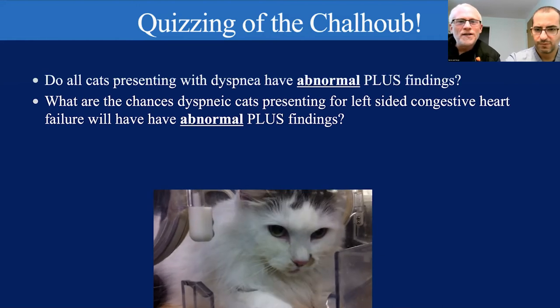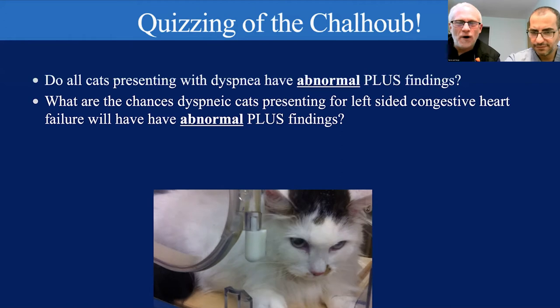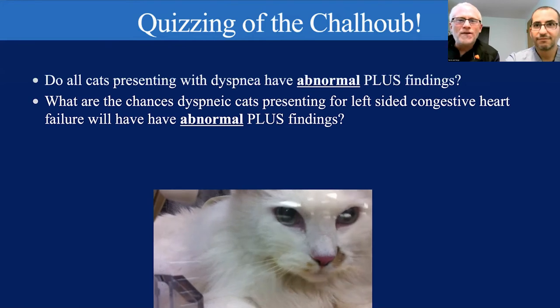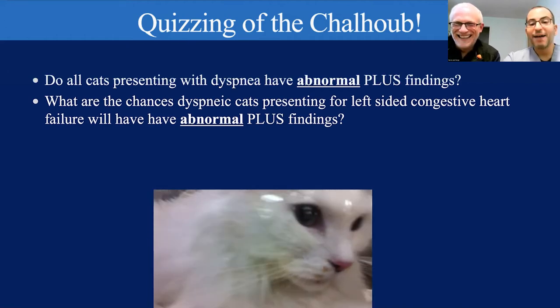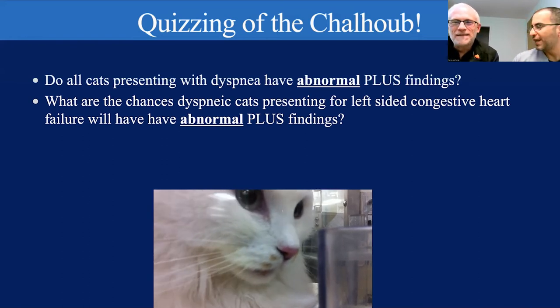Now, next question for you, Dr. Chalhoub. What are the chances dyspneic cats presenting for left-sided congestive heart failure, so those coming in with respiratory distress, difficulty breathing because of congestive heart failure, will have abnormal PLUS findings? Can you repeat the question? I'm kidding. I'm just going to say yes, Dr. Boysen, and I'm going to commit to yes, they're going to have abnormal PLUS findings more so than not.